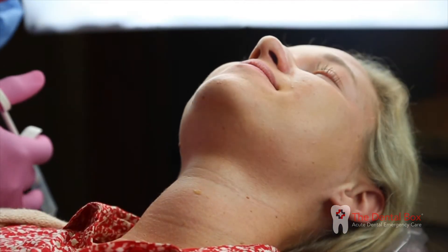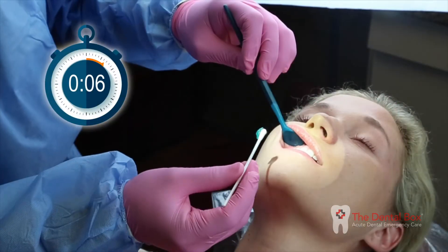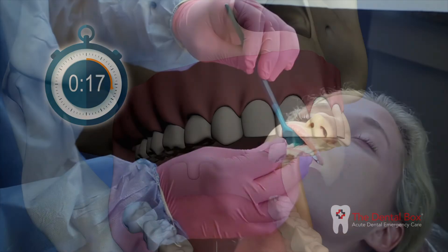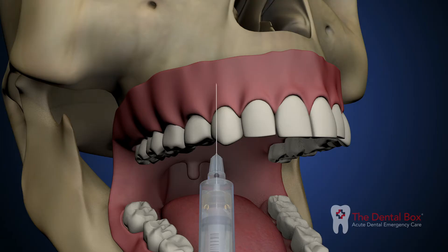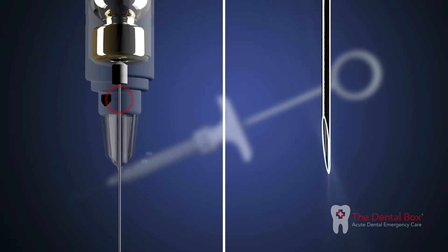Position the patient supine if possible. Locate the soft tissue or tooth that requires anesthesia. Clean the area with dry gauze and apply topical benzocaine gel for one minute. Orient the syringe with the needle bevel towards the bone. The black marker on the syringe indicates the bevel location.